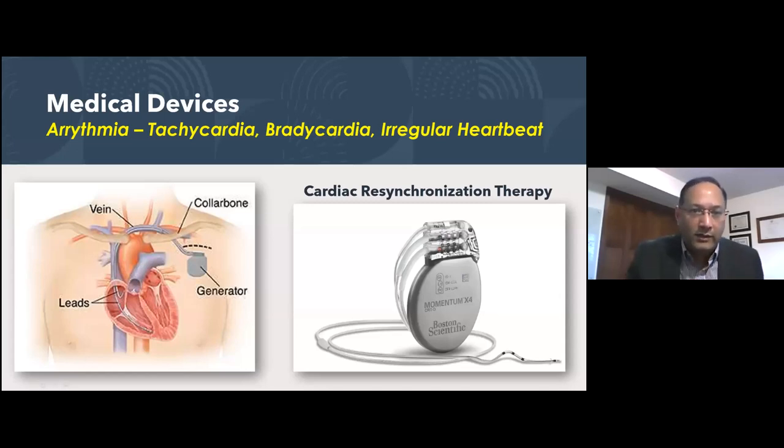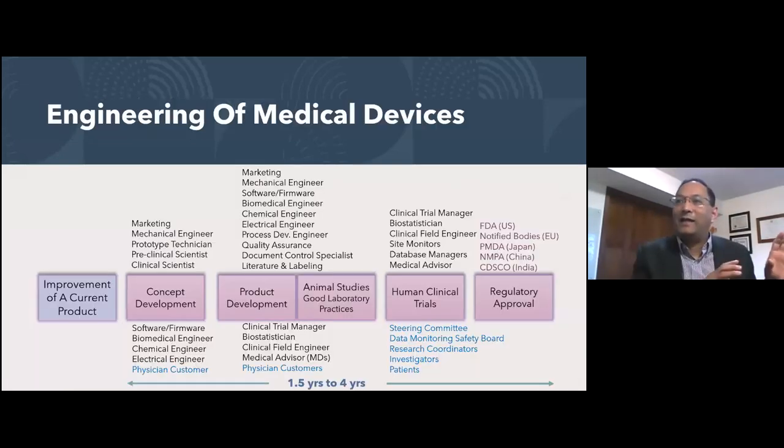So you can see this particular lead has four electrodes, pacing at different frequencies, at different times, at different locations, which are becoming the new ways of managing heart failure patients. So that's all I could pack in terms of the devices.